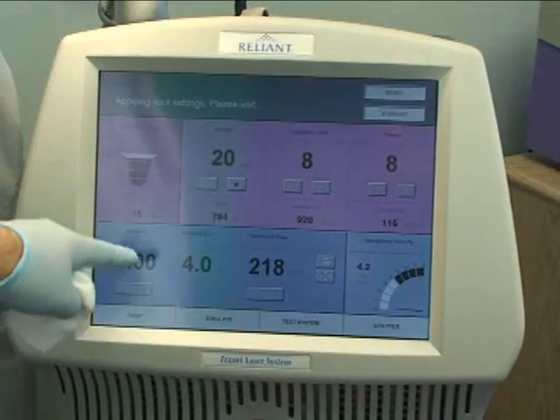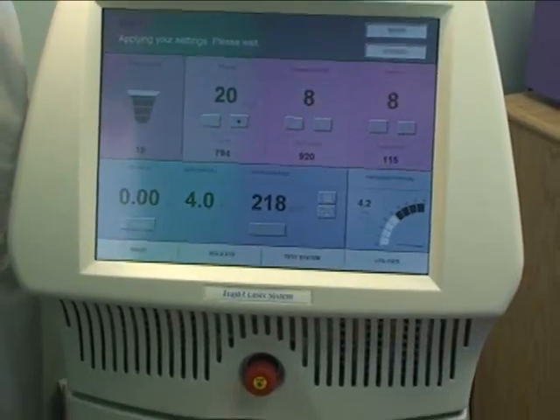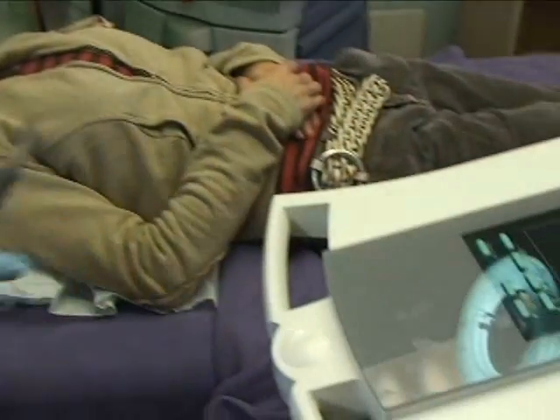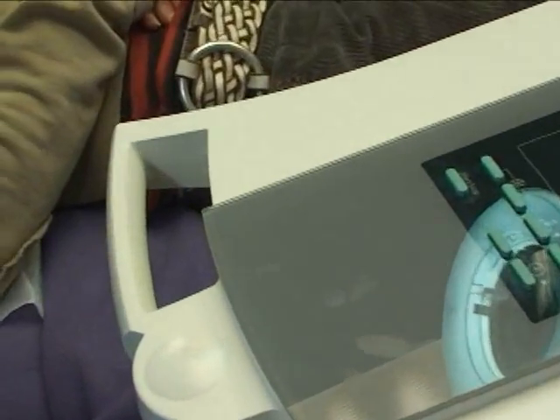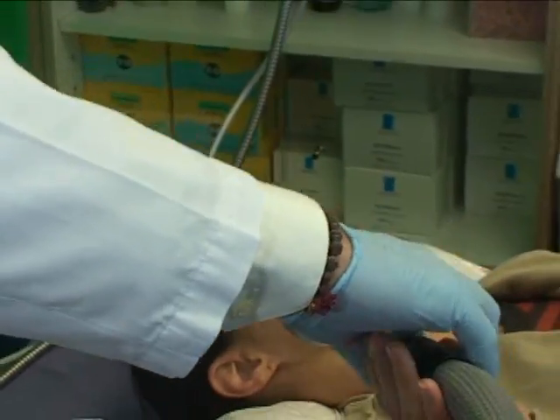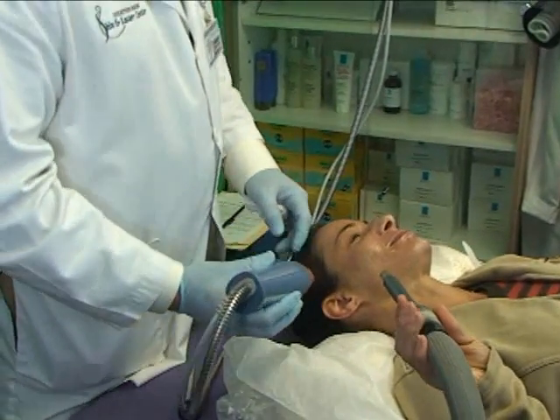And as we go along, you'll see that the actual kilojoules will start to advance, and that's what's going to determine the amount of energy we've done on this treatment level. We use this machine here, which is called a Zimmer. Basically, it's like a giant refrigerator or air conditioner that blows a column of cold air that the patient can maybe help me by holding it in the areas that we're going to treat. It's a good way to distract as well as to minimize any type of heat discomfort she may feel.